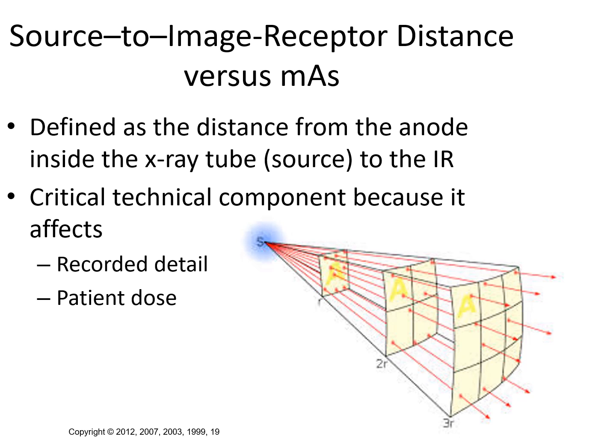So you can see the first distance is called R, and that's 1, 2, 3, 4, 5, 6, 7, 8 photon strikes in area A. At 2R, the beam has quadrupled in size, and so now those same 8 photons are spread out over 4 times the amount of area, and so the dose, you only intersect 1/4 of the original intensity.